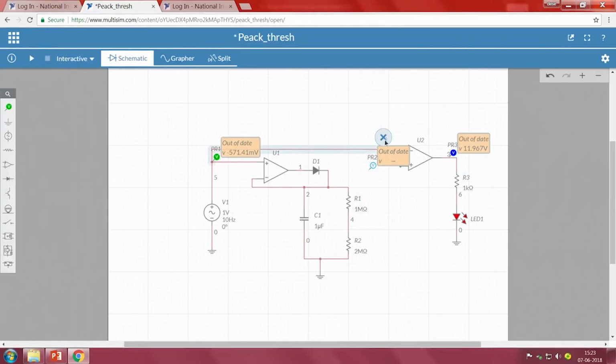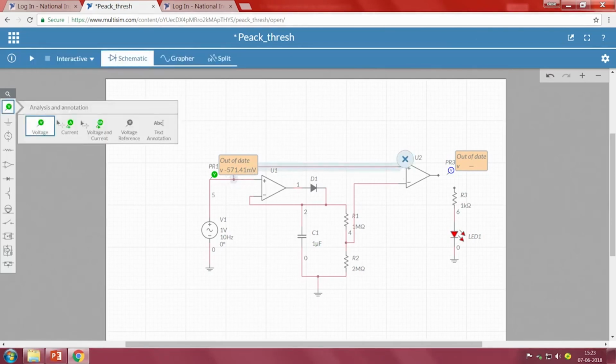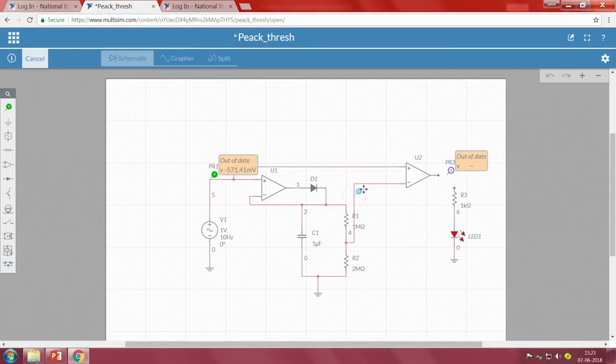I will swap the terminals. Okay. This particular terminal should be connected to here and this is here, and this particular terminal should be connected here, right, that is input, and here I am going to measure the threshold value. Okay. Now let me run it.